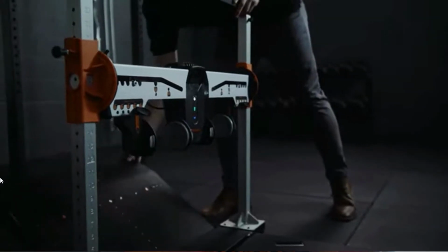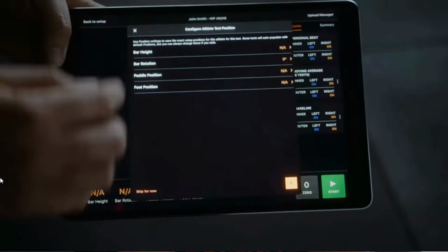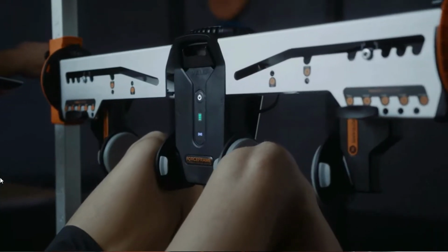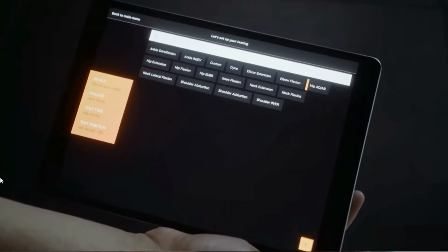The ForceFrame, now, as we start diving into handheld dynamometry versus isometric dynamometry in general, whether you're testing on the CSMI or other larger devices, you have to make sure that the reliability and protocol are consistent the entire time to have the highest amount of reliability. And so the ForceFrame is basically an H-frame system that has two paddles, an inner and outer paddle, on the left and right side. We can put some links in the show notes, but the way it's set up allows you to rotate the bar at 5-degree increments from 0 to 180, theoretically 360, but 0 to 180, as well as raise the entire crossbar from the lowest all the way to the highest.